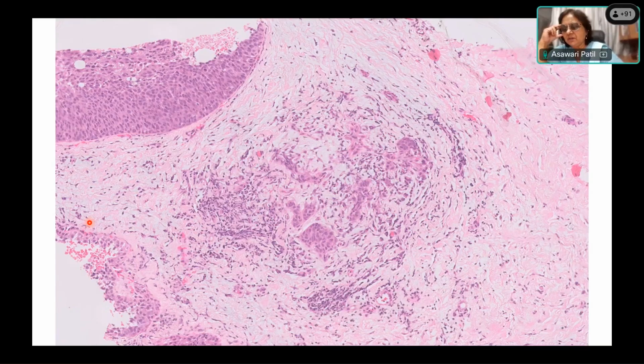So what is the cutoff here and why is it important? If it is microinvasion, it should be less than 1 mm. Okay, so up to 1 mm or less than 1 mm is microinvasion. Microinvasion. And does that matter in core biopsy? Yes or no?